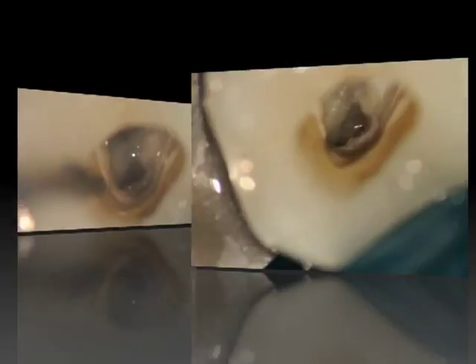Once it's been used, I find ultrasonics are great for cleaning up the floor. The water and the sonic vibrations are great for cleaning up the floor and giving you your ability to see. Here it is immediately afterwards and you can see that we're using little instruments to check the MB fin to see if there is an extra canal there — and indeed there was.